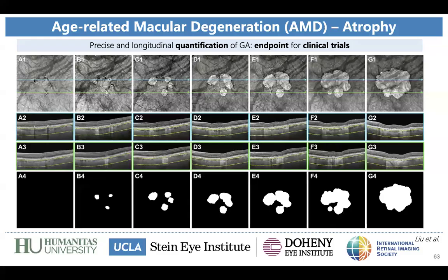Extremely important point, especially for clinical trials. As you all know, of course, the thickness of the choroid is different in different patients. So we should very carefully adopt different slabs in the choroid to visualize hypertransmission defects, because there can also be the influence of the sclera in some cases.